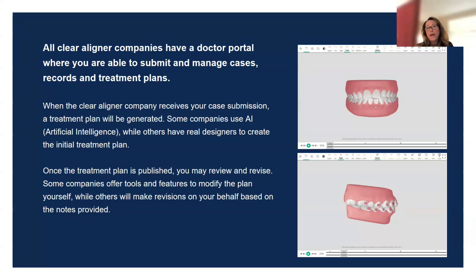So what happens is once it's submitted, some companies do the AI, the artificial intelligence, and then there are real designers that create the case. With some aligner companies, you'll get a notification saying that your treatment plan is completed, and then you can open it up and view it.